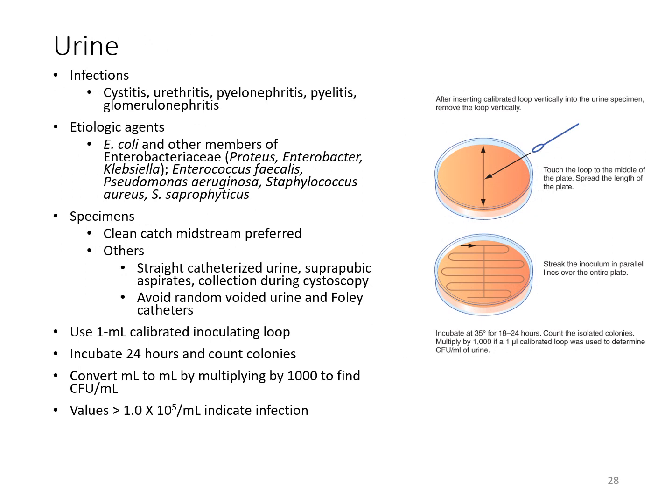Urine specimens, we're looking for some sort of infection within the urinary tract. Of course, you've got mixed organisms, gram-positive and gram-negative, that can cause infections here. And potentially, if a urine is submitted to the lab, Trichomonas could be in there, but it's not really going to grow on your plate. So hopefully that was caught if the urine specimen was done in urinalysis and a microscopic was performed.